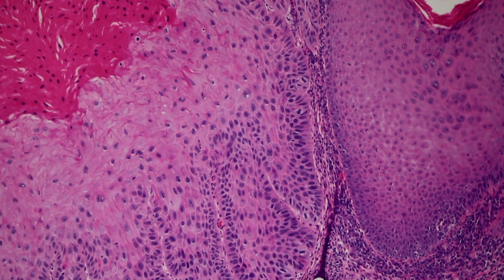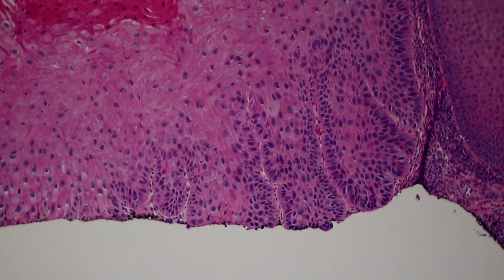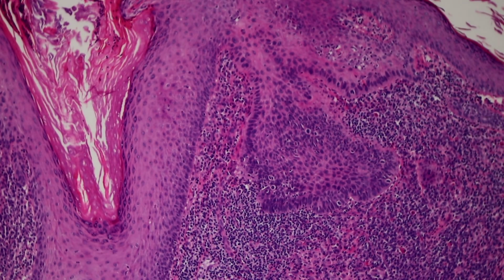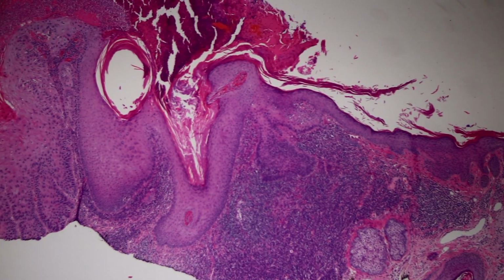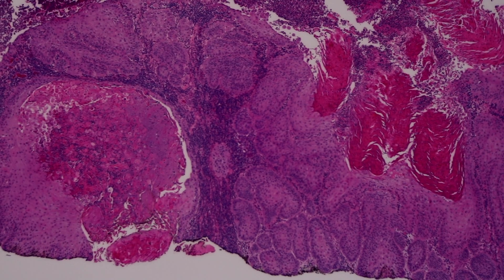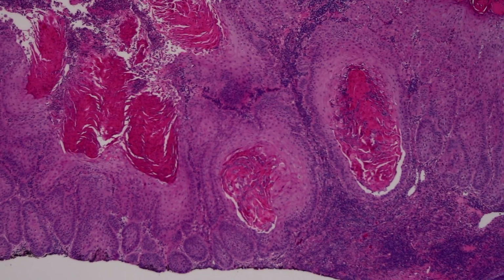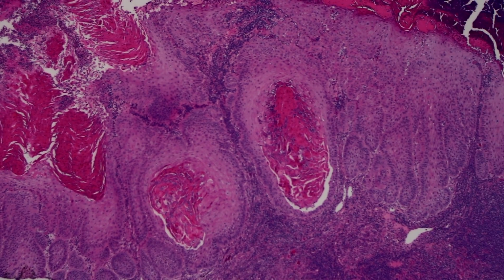Transplant patients tend to have squames that are very aggressive as well because their immunity is diminished, and patients with CLL have diminished immunity. So if you think there's a bunch of lymphocytes more than usual and they look very uniform and monotonous, with that kind of soccer ball appearance of CLL. I'm not very good at hemepath, but I feel like a CLL has kind of a look.